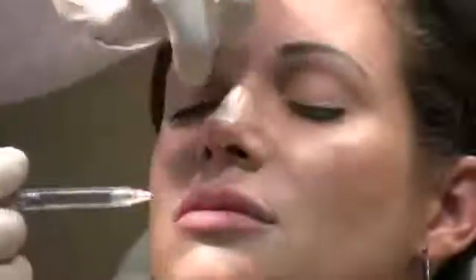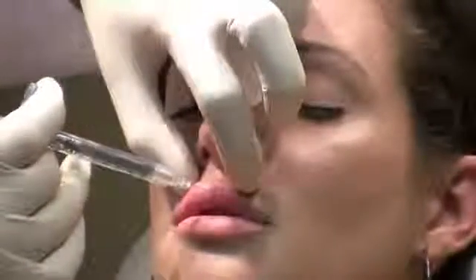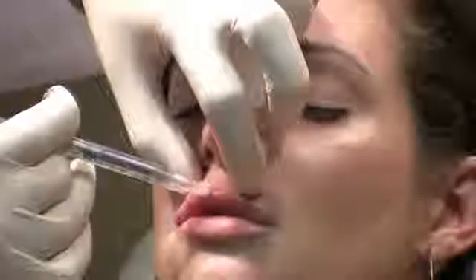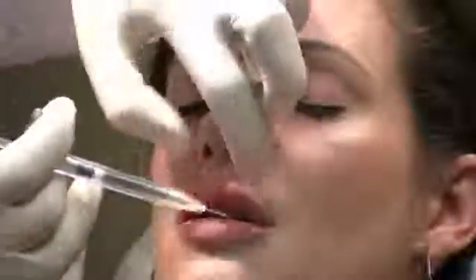As I've said before, if you fill the lips like a sausage link, they'll look like sausage links. Open your mouth just a little bit. A lot of times patients will not have sensation or control over their lips, so they may think that the mouth is open when it's not. You just have to gently remind them.